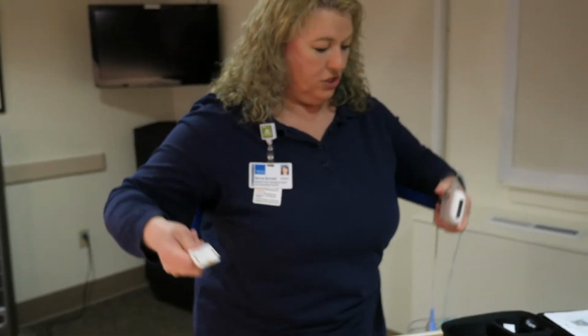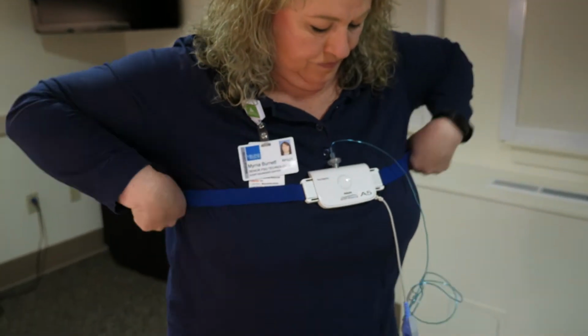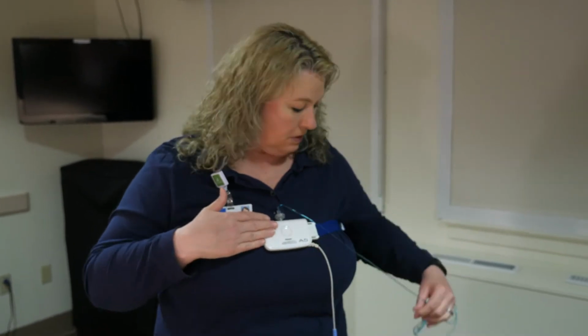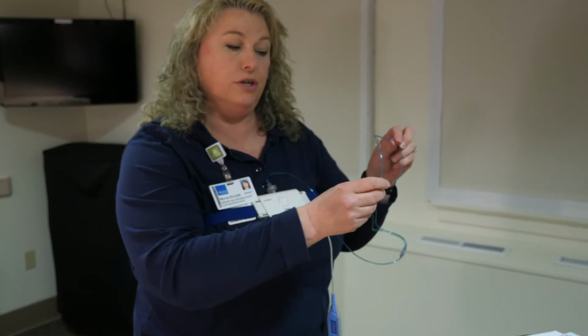This is going to go around the chest. Right up here. We're monitoring your lungs. So as you're breathing in and out, the belt is going to stretch in and out. So we want this to be up here. Okay? Step 2 is the nasal cannula that goes into your nose.